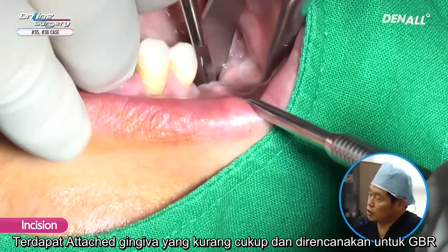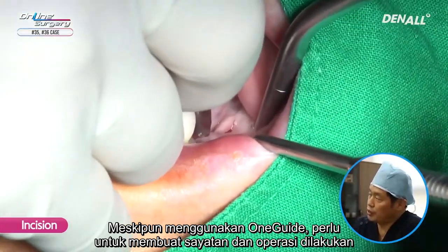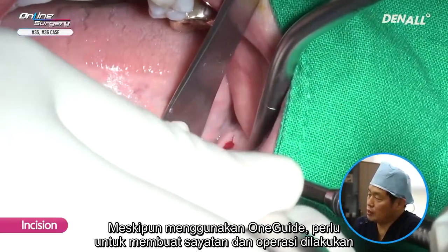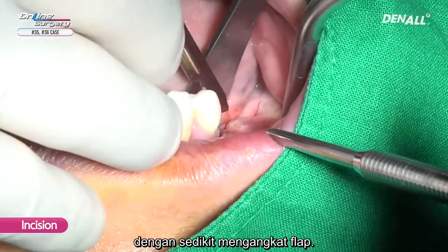There was insufficient attached gingiva and GBR was planned. Although OneGuide will be used, an incision was made and surgery proceeded with a slightly reflected flap.